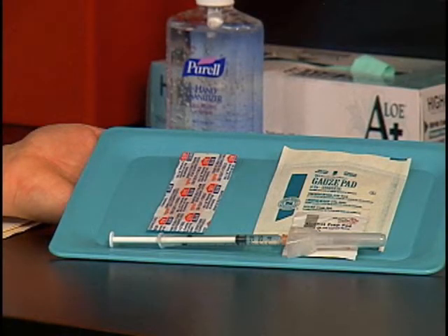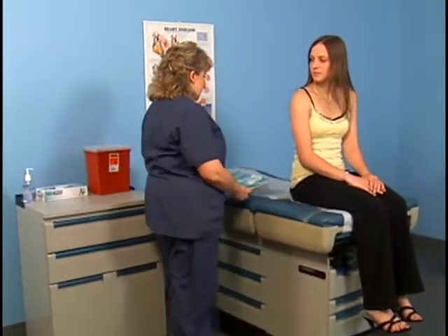Draw up the medication and place the needle and syringe on a tray along with an antiseptic wipe, a gauze pad, and an adhesive bandage. Greet the patient and introduce yourself. Hi, I'm Diana. Hello. Identify the patient by full name and date of birth. Explain the procedure and purpose of the injection.